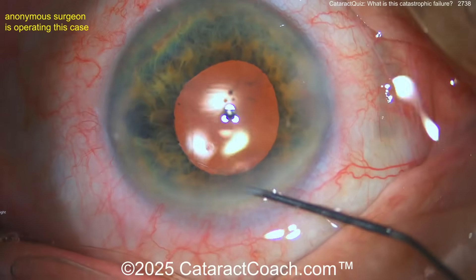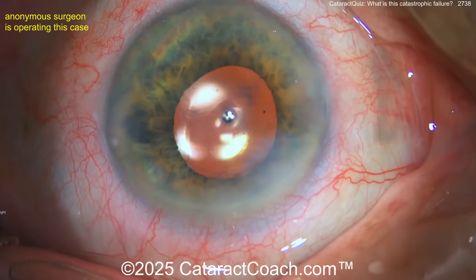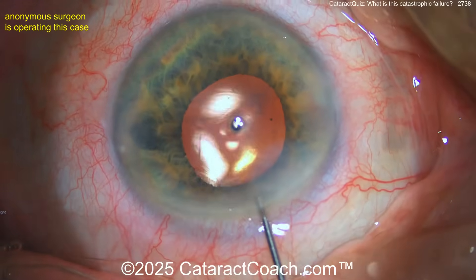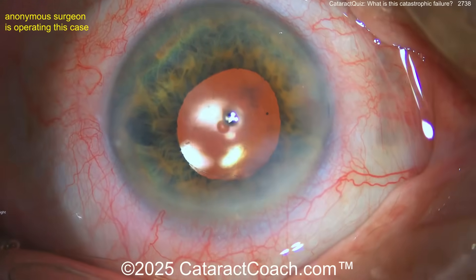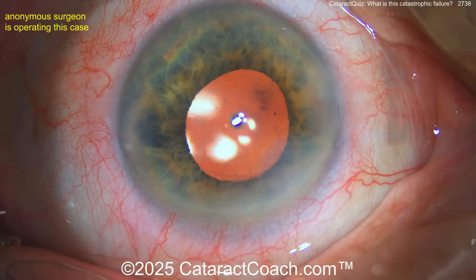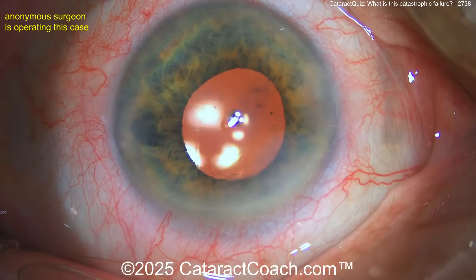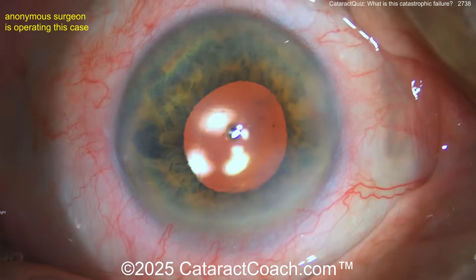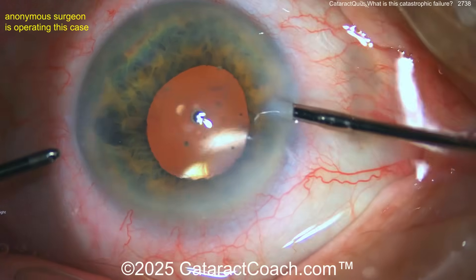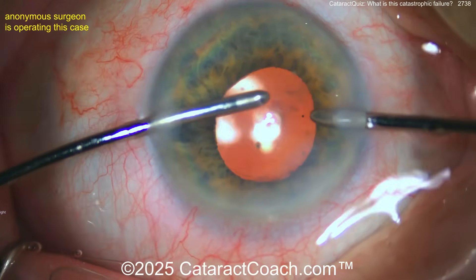Hydrating the main incision — a little bit to the side. There's still what looks like a Descemet's flap. Some more hydration; lens in the back, posterior capsule intact. Now look at the right of the incision — there's a wrinkle, a fold there. That hydration caused a bigger Descemet's detachment just to the right of the incision.